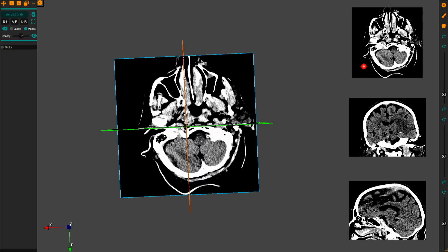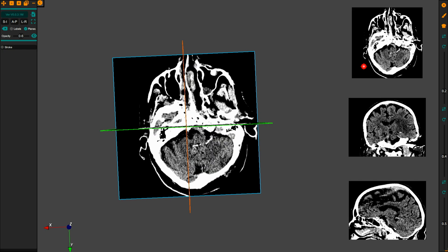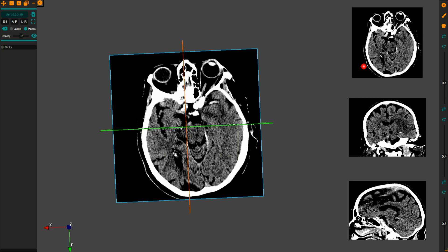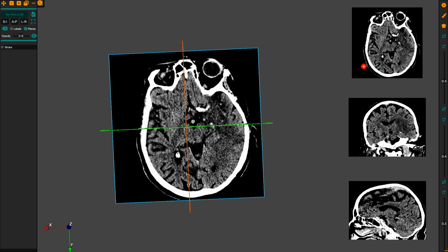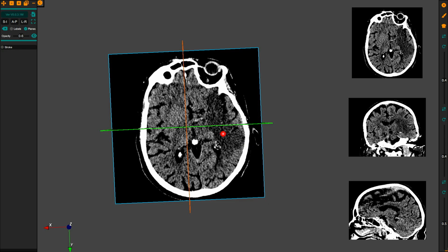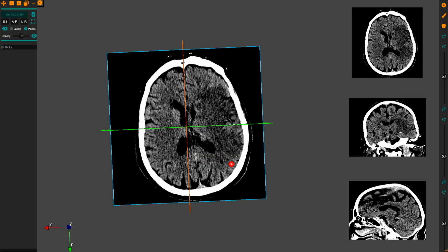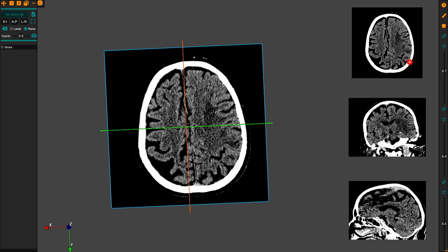This is a stroke and as a radiologist I go from below up. I see the posterior fossa structure, brain stem, fourth ventricle, and now we are in the supratentorial compartment. You can see that on the left side there is a large, fairly well-defined hypodense lesion on this CT scan. As we go further, this hypodensity is increasing, involving the grey matter and the white matter and also part of the basal ganglia. This is corresponding to the MCA territory — this is a classical MCA infarct.